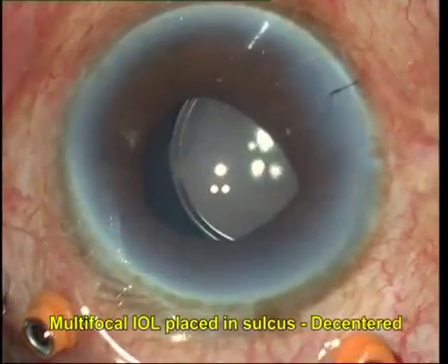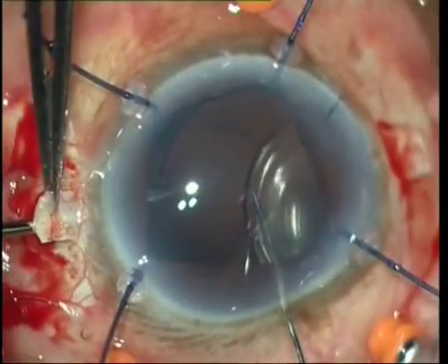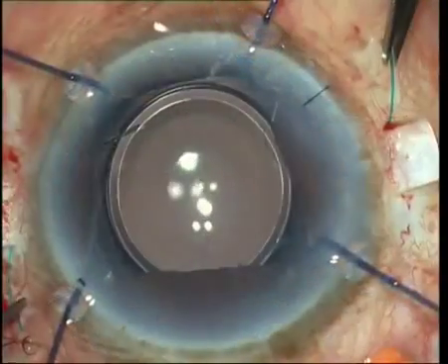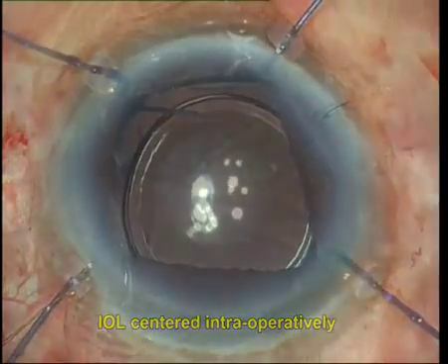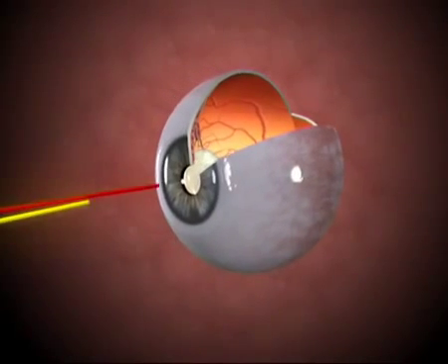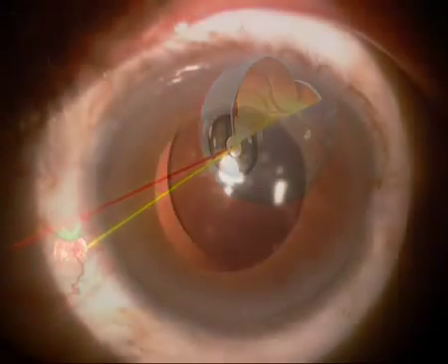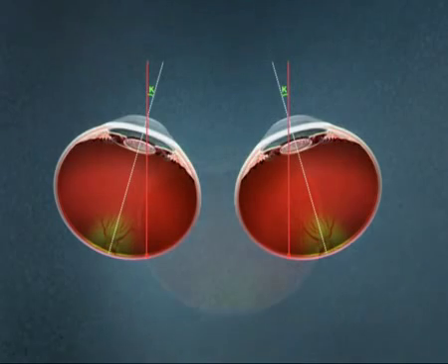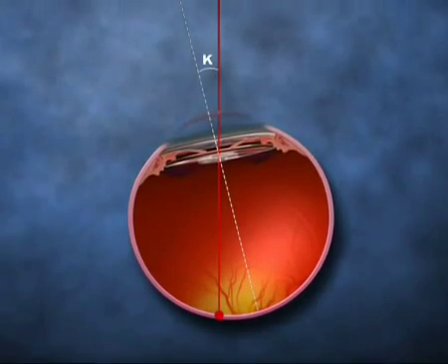We are currently undertaking a feasibility study for positioning the central ring of the IOL under the visual axis, and the results may throw more light on this evolving concept. It is important to focus more research on the association between angle kappa and multifocal IOLs. To conclude, we propose that it may be important to consider angle kappa for all prospective multifocal IOL patients and to avoid multifocal implantation in patients with large angle kappa till the time advances make accurate centering of IOLs possible.